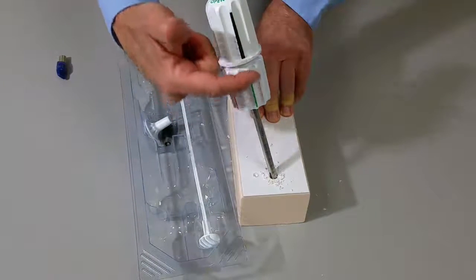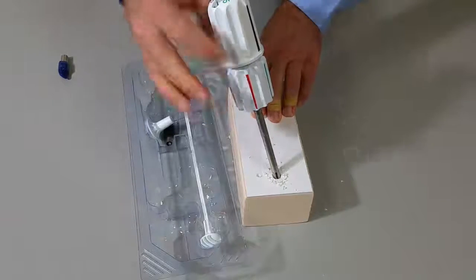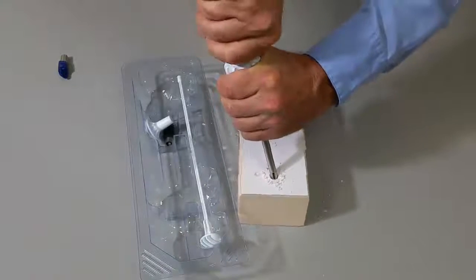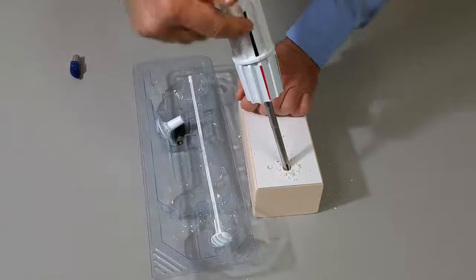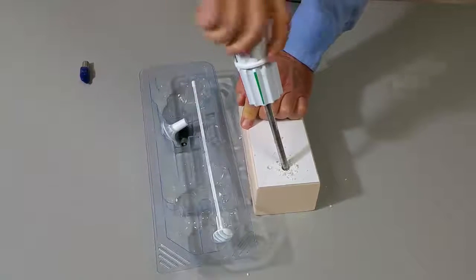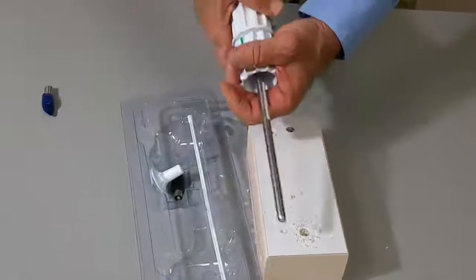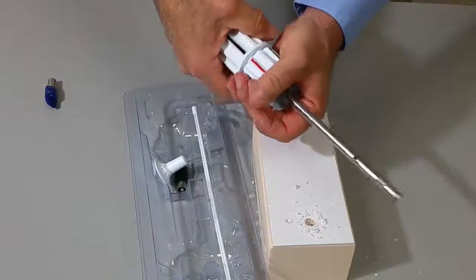You can see that the black and the green lines are lined up for this initial insertion position. We're now going to rotate the black upper handle line to the red lower handle line, which will secure the cancellous bone. This is done with a forceful grasping and rotation — in effect like you're wringing out a towel. You have to use that kind of gripping force to get the black line lined up with the red. There is a distinct locking click that you will feel and sometimes hear as well. On withdrawal, I prefer to rotate it in a clockwise manner as I'm withdrawing, as it will reinforce the locking as opposed to rotating it counterclockwise while withdrawing.